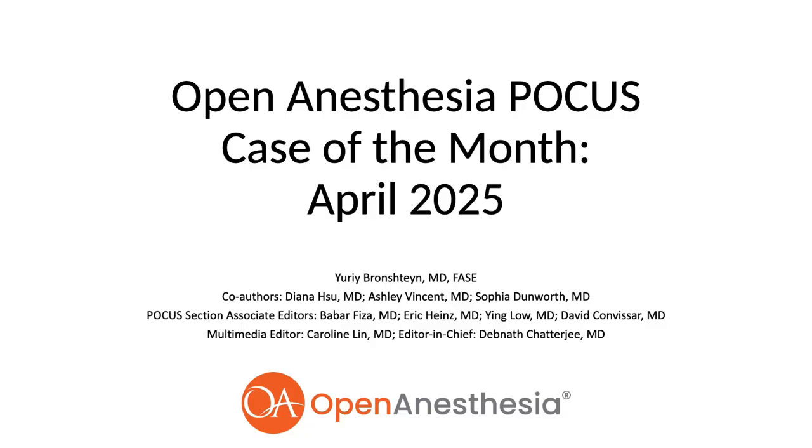I'm an intensivist and anesthesiologist at Duke, and I will be presenting the April 2025 POCUS Case of the Month for open anesthesia. This case builds on the March POCUS Case of the Month, Intro to Lung Ultrasound. If you have not already watched that video, I encourage you to do so before viewing this case.